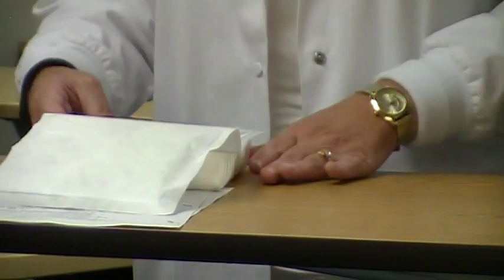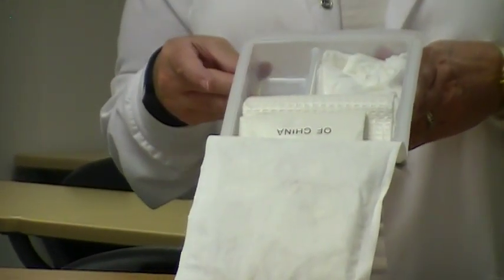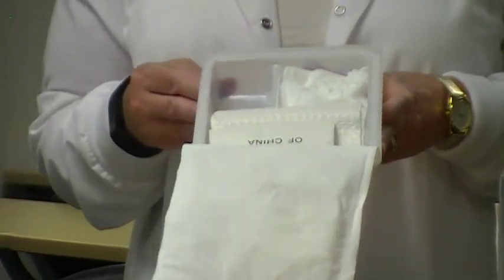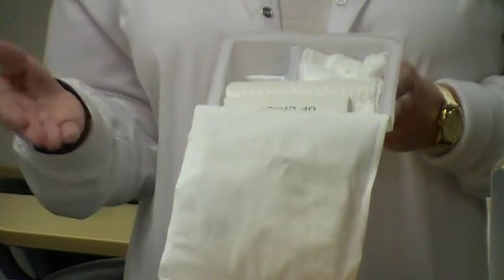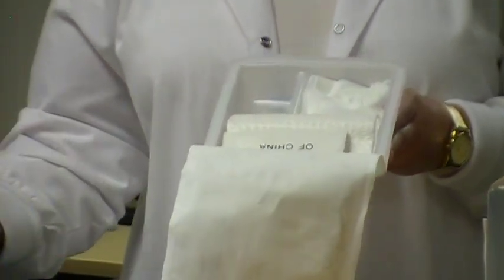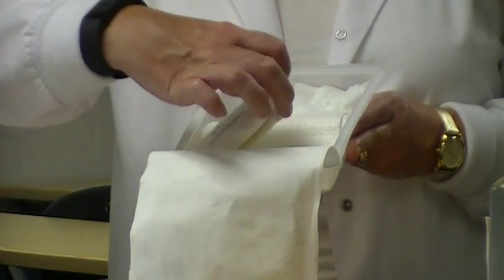The next thing that I'm going to do, if you look inside my package, you'll see that I have a package of sterile gloves. Now, again, depending on what skill you're doing or what you're setting up, you may have to have a set of sterile gloves that are outside of the tray. So here they are on top, so I'm just going to grab them, lift them out, set my tray back down. Then I'm going to come to the side.